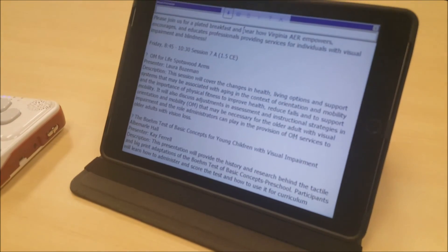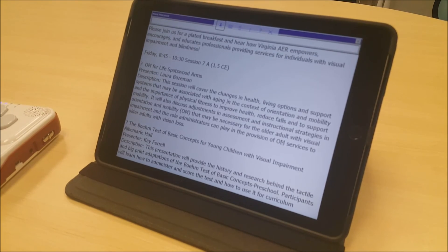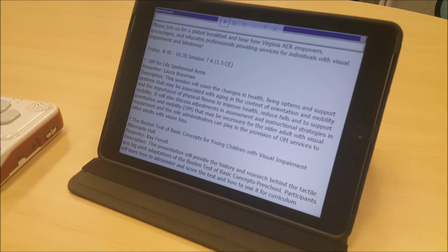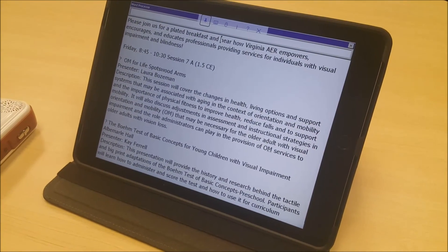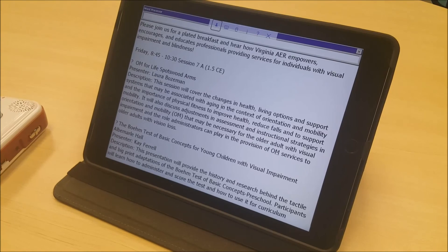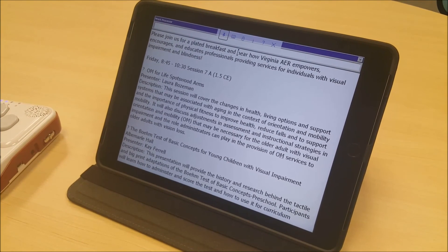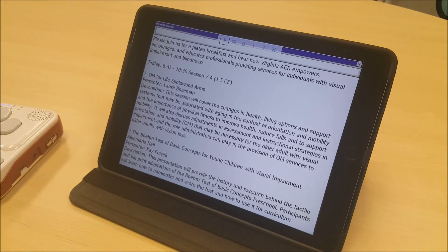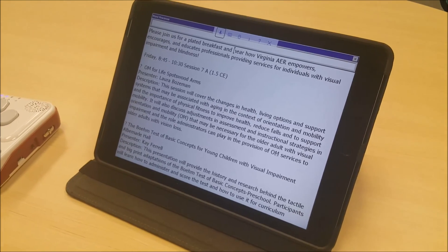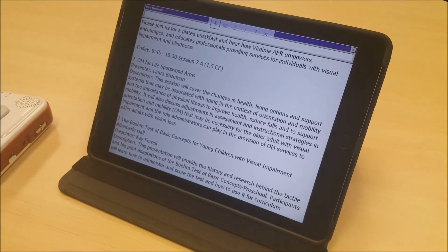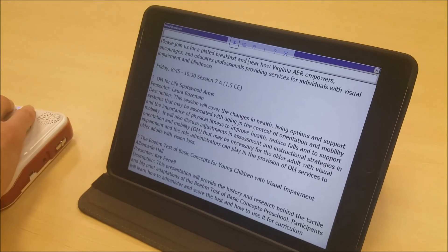You can see an entire screen worth of information. Note that to do that, we turned Word View on, which is in the Settings menu under Files. So you would go into the Files menu, Settings, and then to Word View, and make sure that that is set to Yes. If so, you'll be able to look at an entire screen of data at a time.